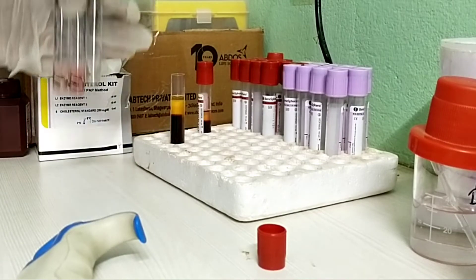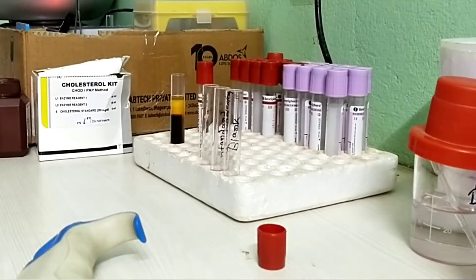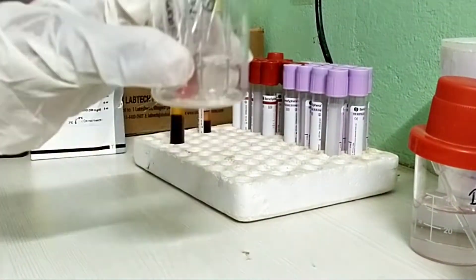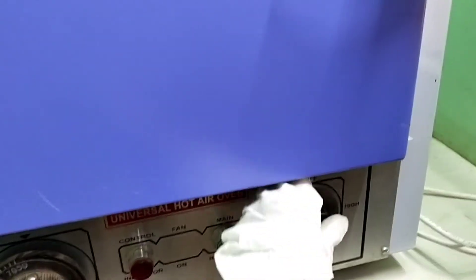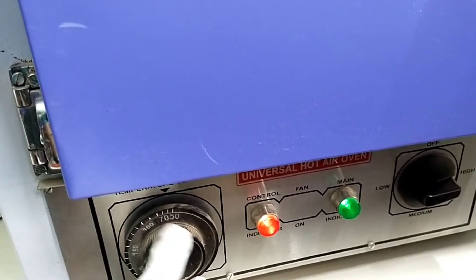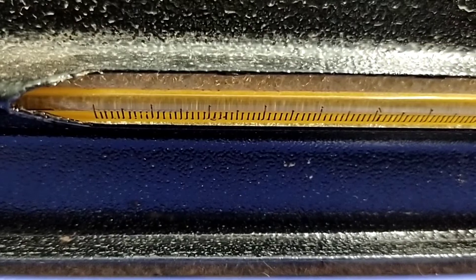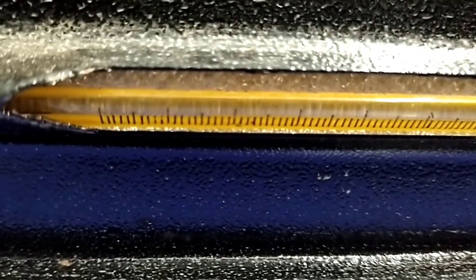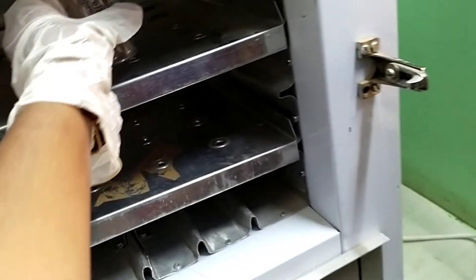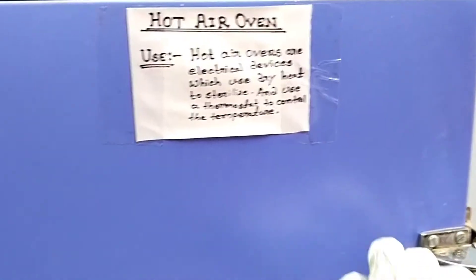The color is developed and the final color is developed after incubation. For incubation, I use a hot air oven; otherwise an incubator can also be used. Set the hot air oven at 37 degrees centigrade temperature and incubate the samples at 37 degrees centigrade.